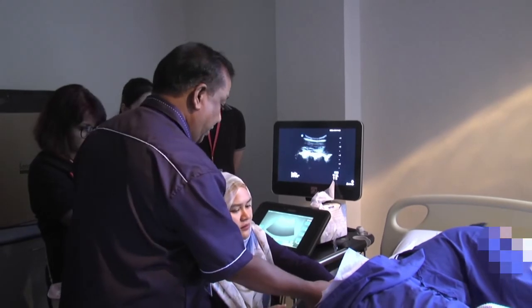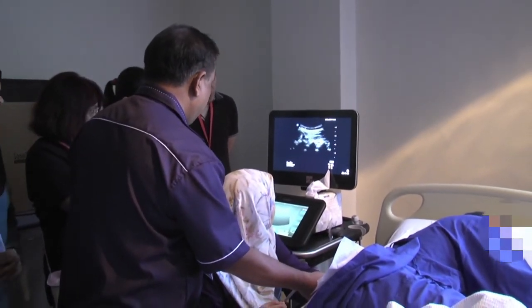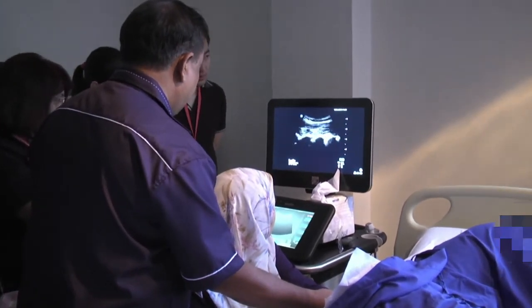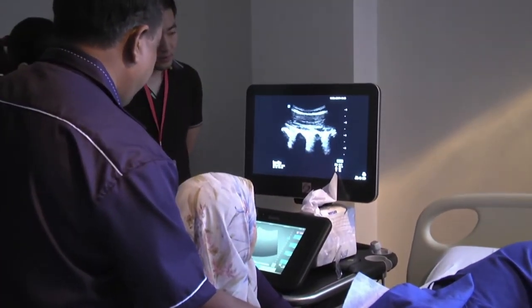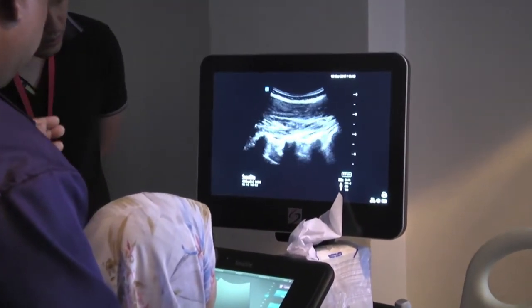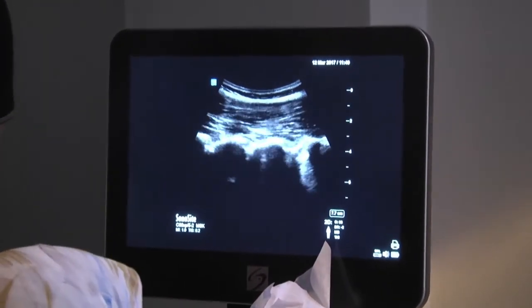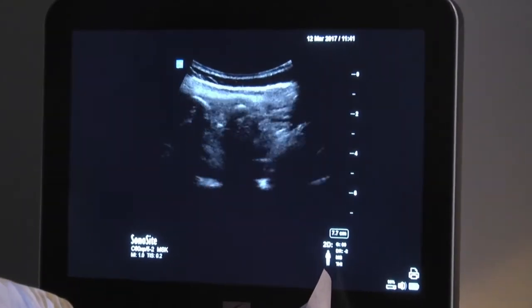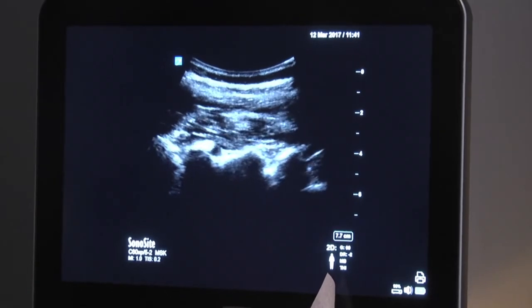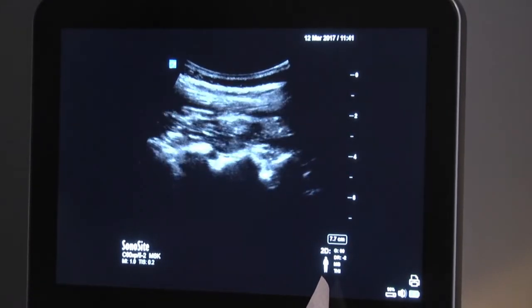Okay, you need to see the articular. This is the lamina, okay? These are the lamina. These are the articular processes, all right? And that's your transverse process. Okay, transverse process also much deeper, see? More anterior. Can you see that? You can see it in this spine model. The transverse processes are much further anterior. Okay, it's gone. Never mind. Okay, so that's it. So, next.